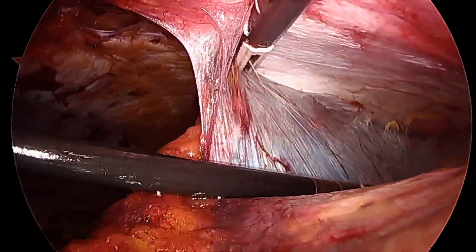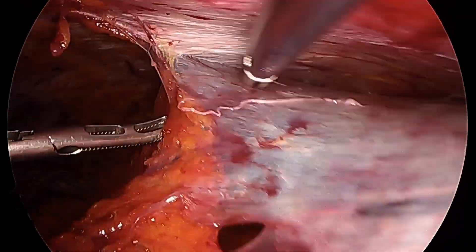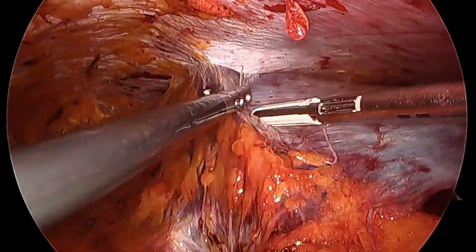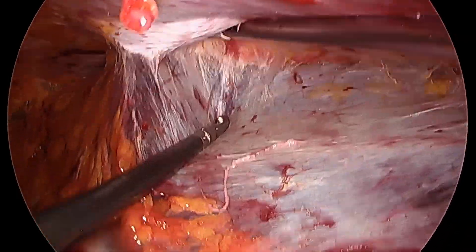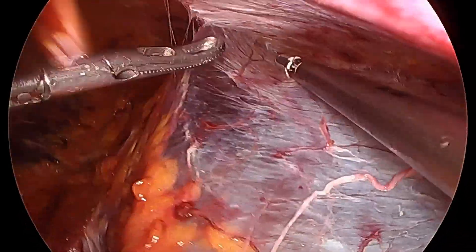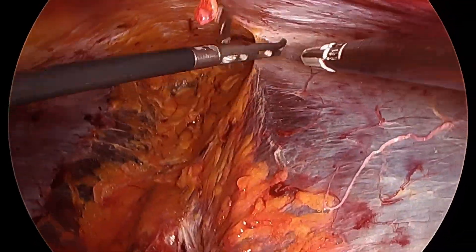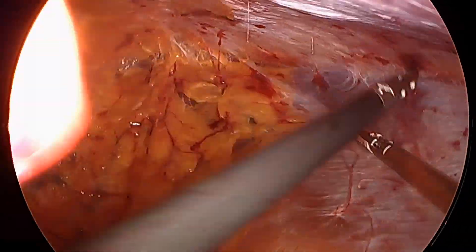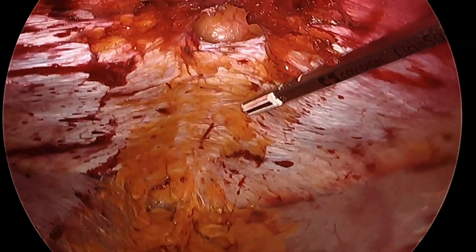At the end of the screen, you see the transversus abdominus muscle. That's a good reference that you have reached the correct area, because we usually don't go beyond the TA for dissecting for this smaller kind of hernias with diastasis. You can see a good example of traction and contra-traction. You can see the full dissection in this area and how thin and friable the peritoneum is where the transversalis fascia joins the midline. But if you go from the transversalis fascia to the preperitoneal space, it's a lot easier to do.